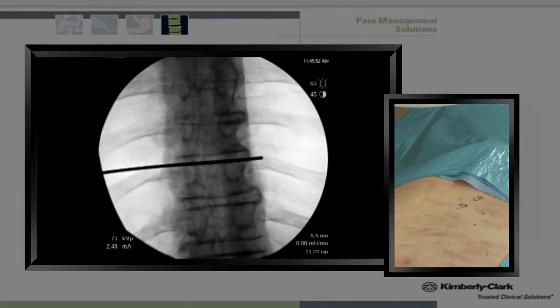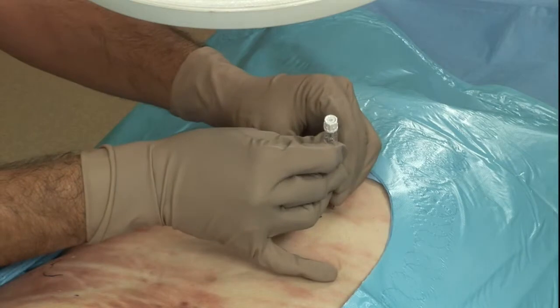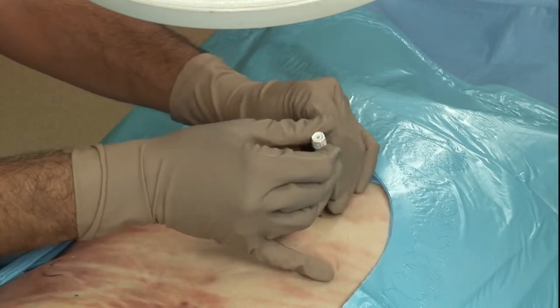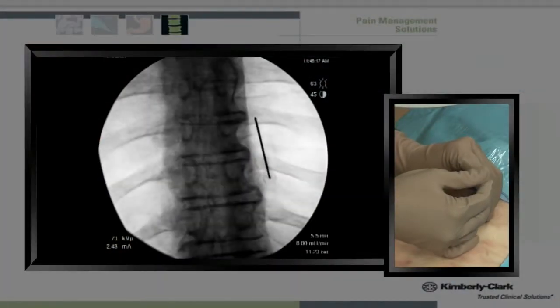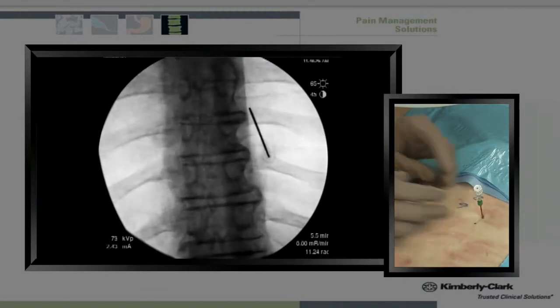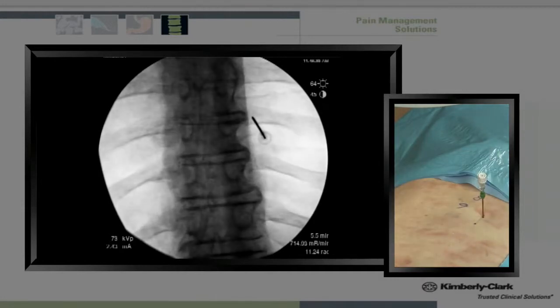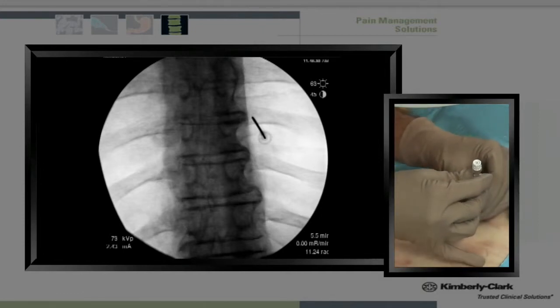Following skin anesthesia, I typically enter the skin just below the superior lateral corner so that I can give myself some leeway in terms of my trajectory. Once I've entered the skin after skin anesthesia, I advance the needle to bony contact, ensuring that I use the bone as a backstop to my placement. And at this point, I'm going to place my additional needle as well.